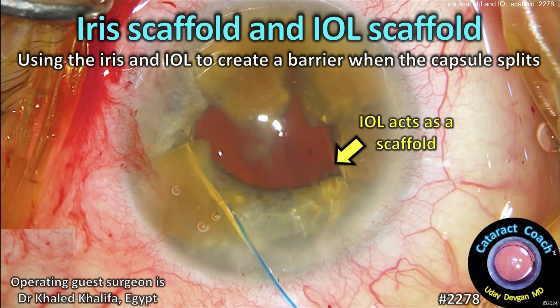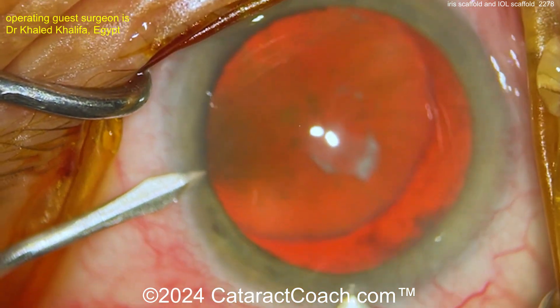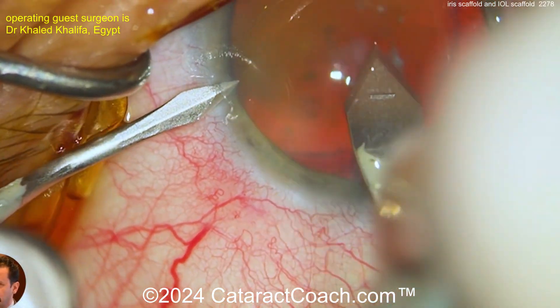CataractCoach.com — iris scaffold and IOL scaffold: using the iris and the IOL to create a barrier when the capsule is weak, split open, or gone.